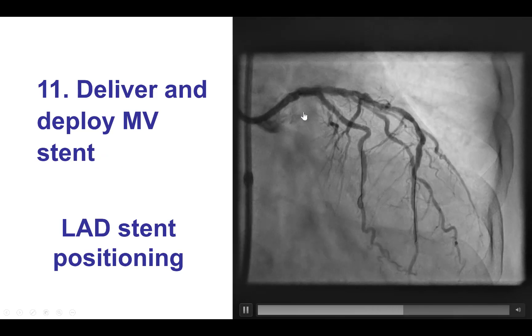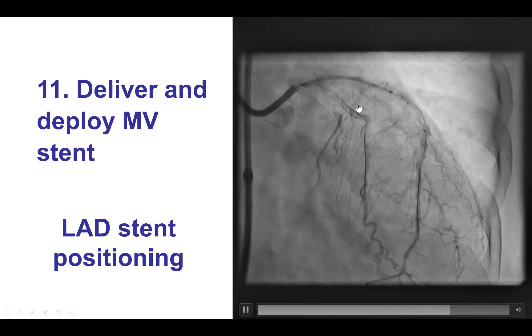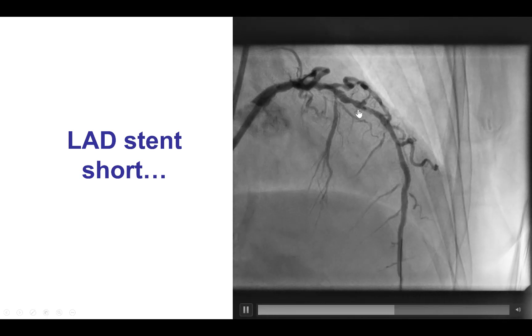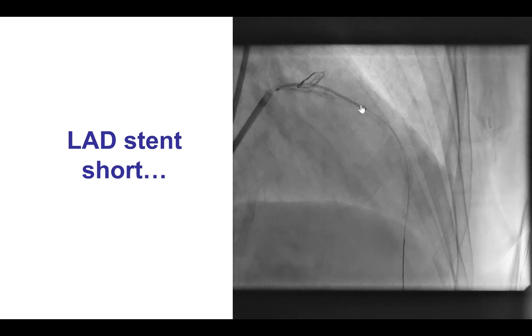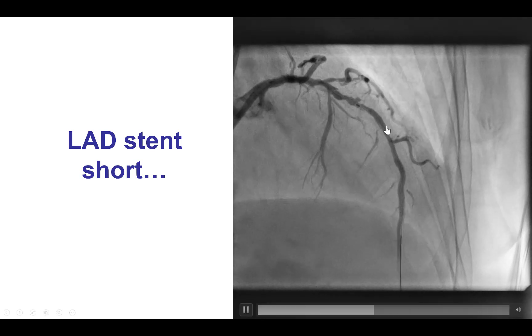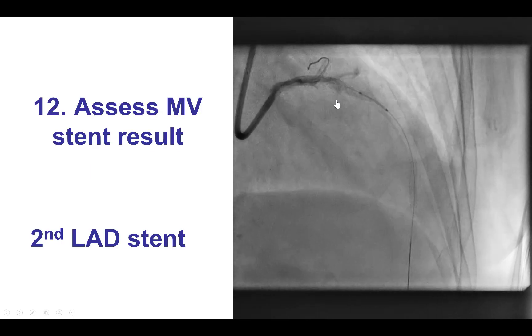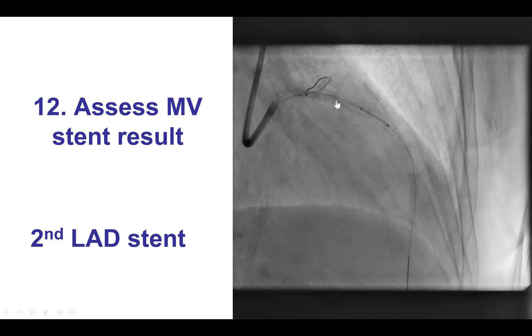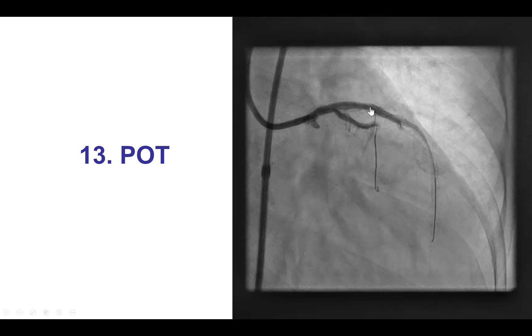We positioned the stent making sure we covered the lesion. It turned out that the stent was slightly short — one disadvantage of not using an automated pullback, which would allow more accurate stent length assessment and could have saved one stent. We deployed the stent and then placed an additional stent at the distal edge of the LAD stent.